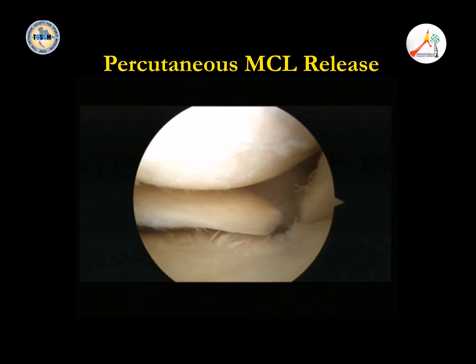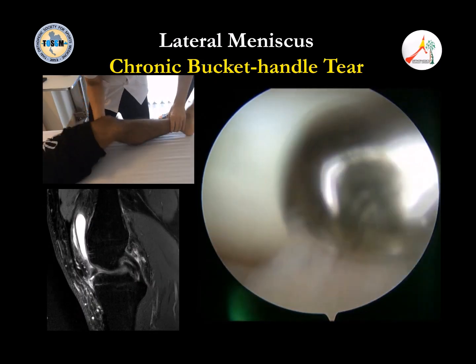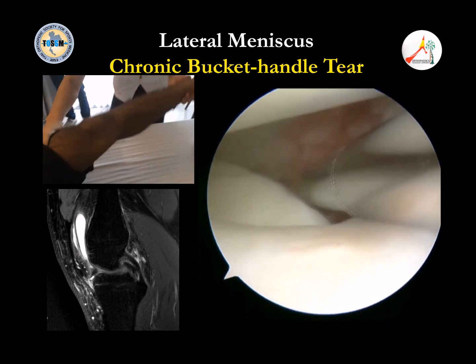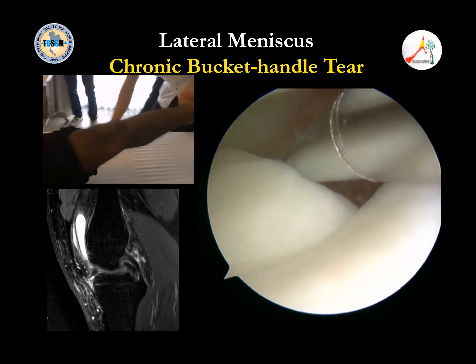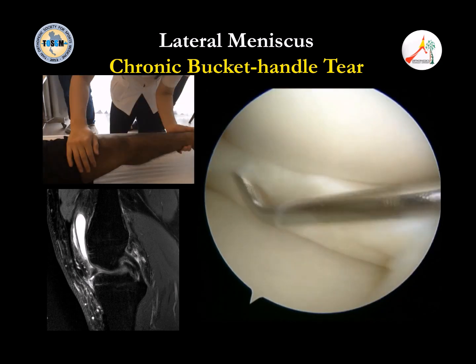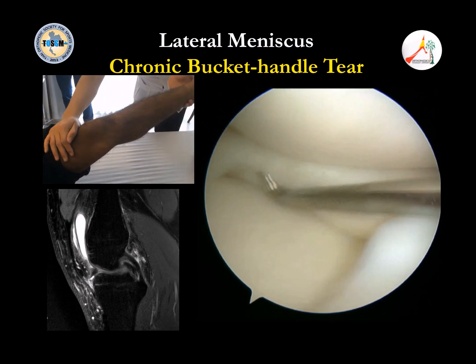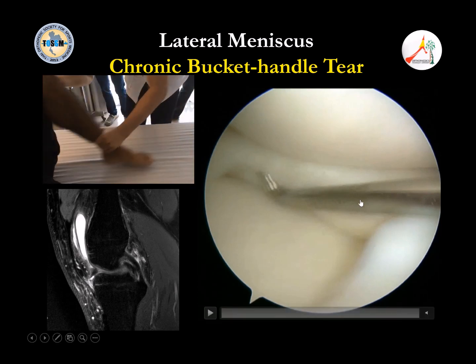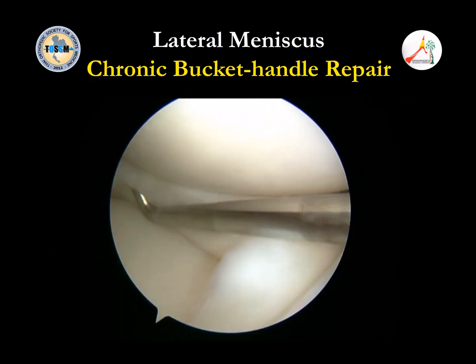And finally, the patient has a meniscus repair with condyle lesion. This is the example of one patient. He has a lateral bucket handle tear. This is very chronic, I think about 1 year. The patient cannot extend the knee. You see this double PCL sign, and also we cannot reduce it. You see, very difficult to reduce this because it's chronic. And also on the lateral side, you cannot make a percutaneous release. You can do it on the medial side, but the lateral side cannot, right?